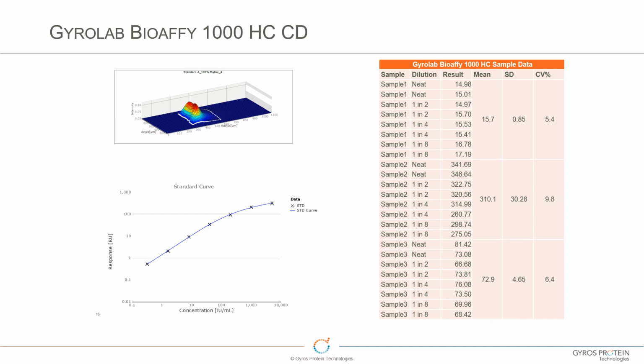The high capacity CD contains a different streptavidin column, so it's more porous beads. What we're theorizing is that the high matrix components tend to get trapped within the porous beads, and therefore we get better flow of the interactants over the column. So the high capacity certainly seems to benefit these assays where we want to analyze neat matrix.